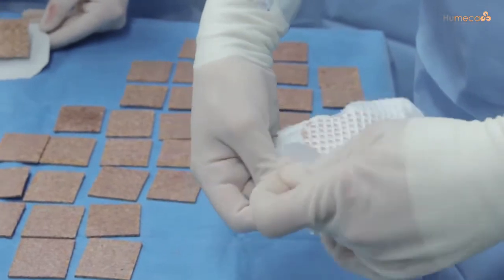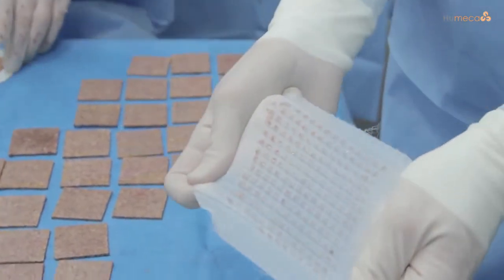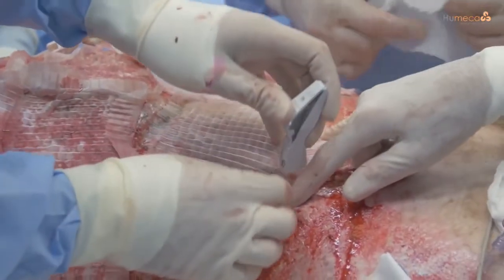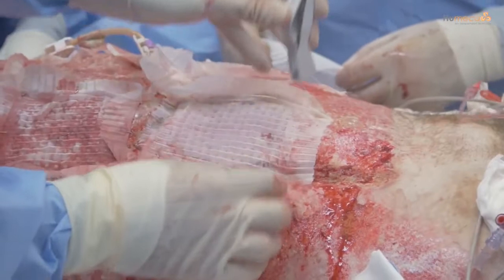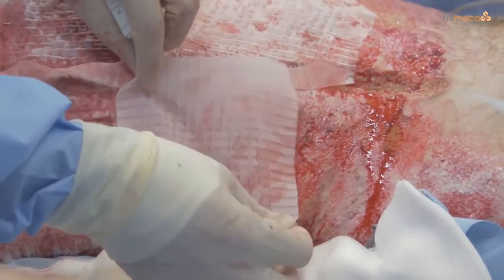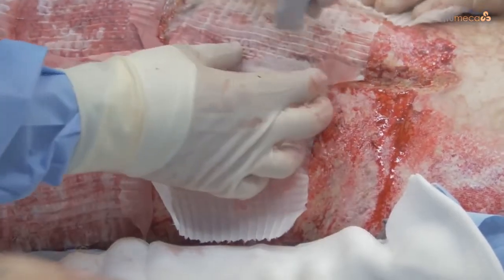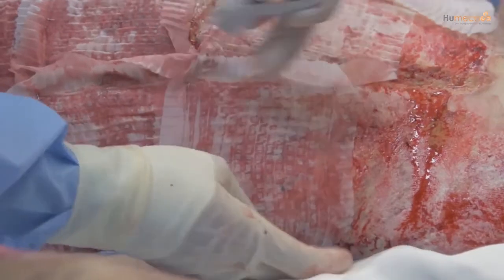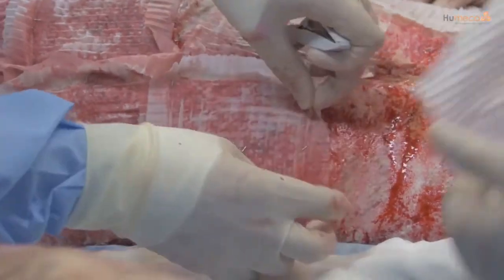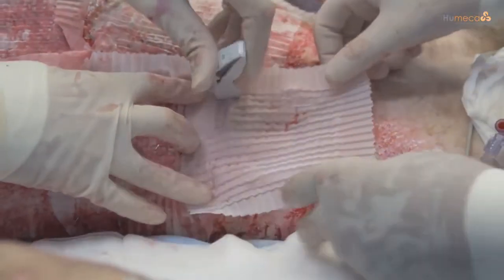Remove the aluminium foil starting from one of the corners — a maximum of 196 skin islands is expanded in a controlled and fixed way. After the usual wound bed preparation, the gauzes are placed onto the wound bed and secured with staples, making sure there is good even contact. Apply the gauze graft side down to the wound bed, stretch the gauze working corner to corner, and flatten it to ensure optimal contact between the skin graft and the wound bed. Secure with staples and fold back the edges of the gauze. Gauzes should be placed close to each other and aligned to prevent additional scarring between each one.